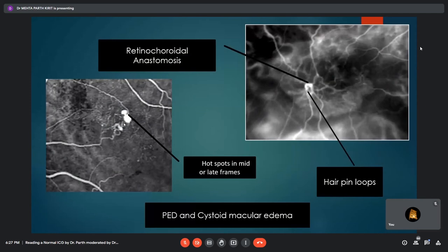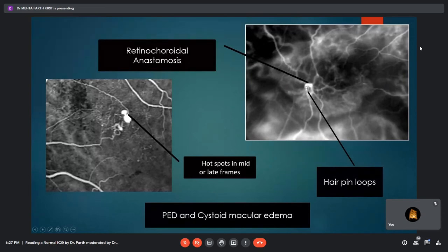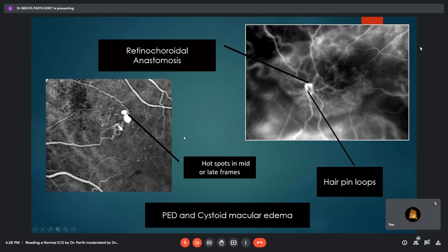Retinal angiomatous proliferation — type 3 CNVM — shows hotspots in mid or late frames associated with pigment epithelial detachment and cystic macular edema, and hairpin loops with a feeding arteriole and draining venule. ICG helps differentiate occult CNVM, which occurs at the edges of the PED, from RAP, which occurs within the PED area. RAP is more aggressive and less responsive to treatment, hence may require a multimodal management approach.